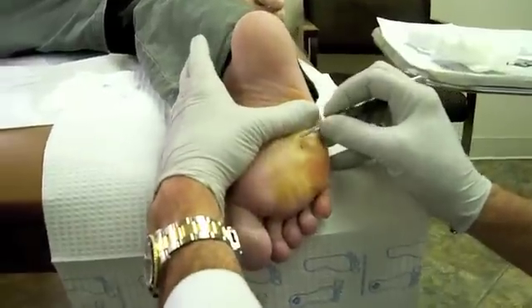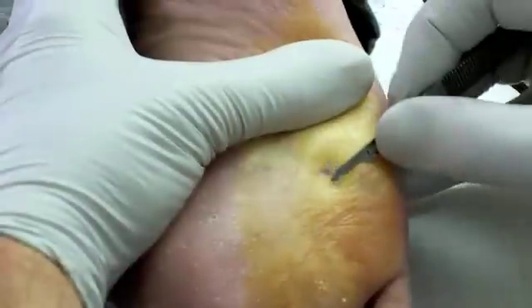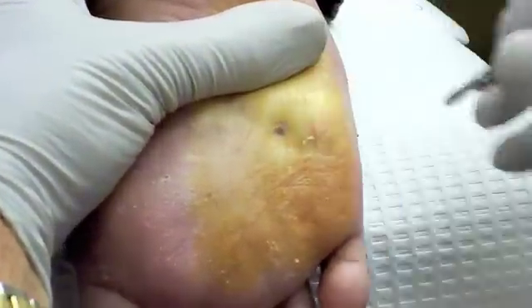So we're going to do a small plantar wart removal here. Are you feeling anything up there? Nothing painful, right? Good.